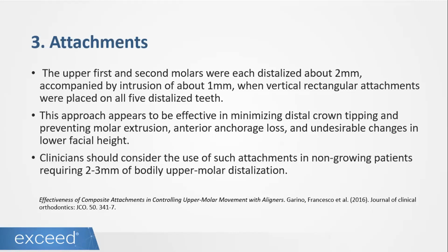Why? Let's imagine here that I have an incisor. But this is useful even when we have veneers and we cannot bond attachments on the buccal surface. So when we have, for example, in here, the center of resistance, our software calculates the moment, and this is something it does automatically to get root movement when we bond an attachment in there. However, if we bond an attachment in here, for example, you can see that the distance from where we are applying the force is going to be different than if I was going to apply an attachment here on the lingual surface. I'm going to be more direct.